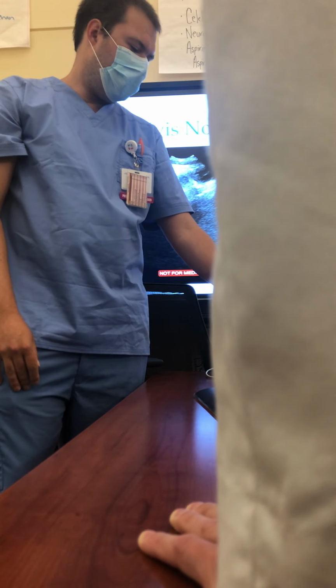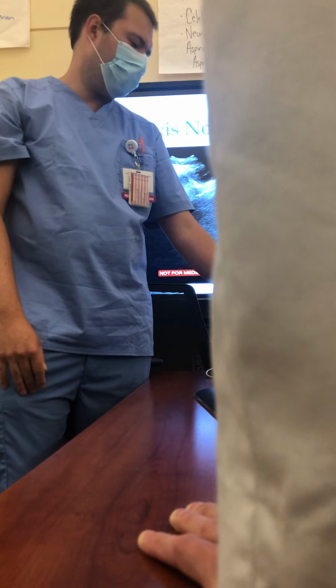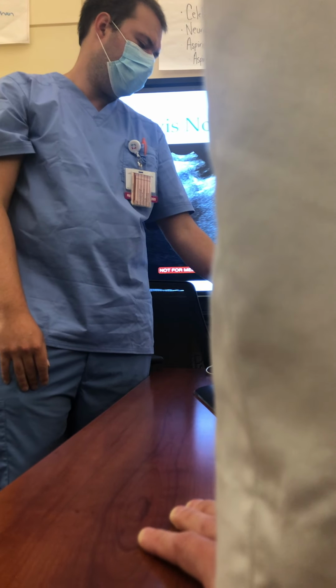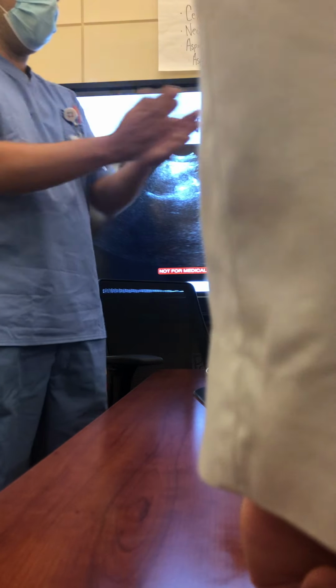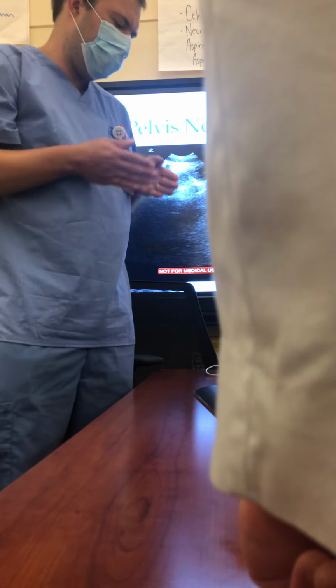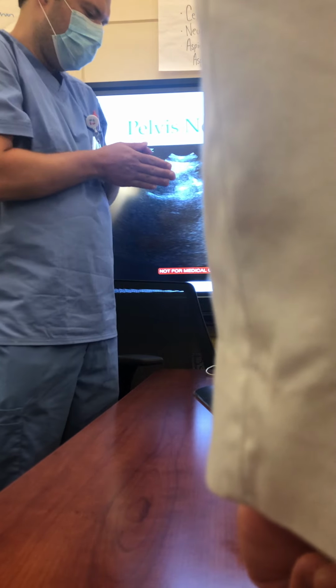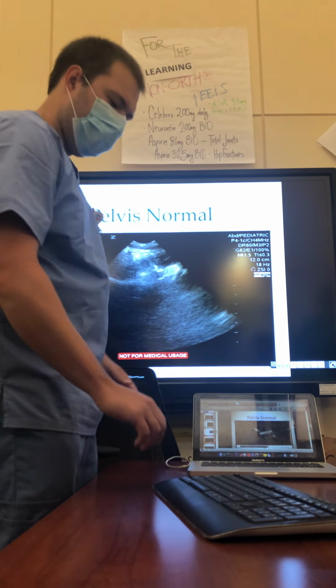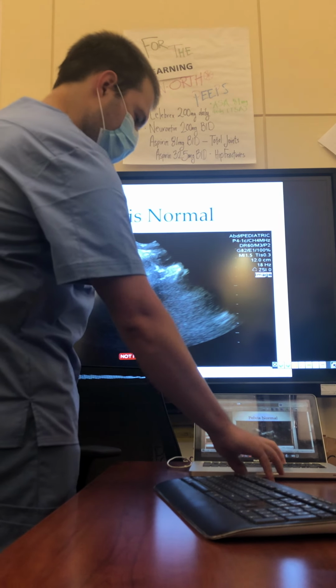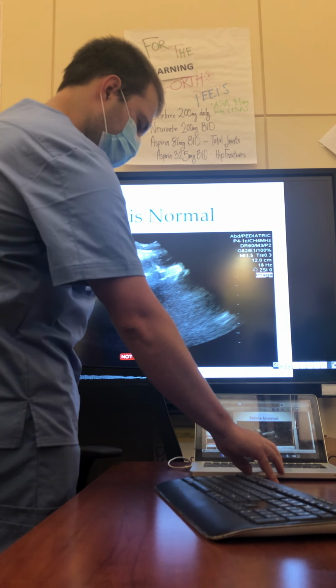This is probably the bowel wall. The seminal vesicles also come through here, but this looks more like the bowel wall. It has two sides to it. It's very linear. It travels in a very straight line, which when you play the clip, you can see when the scanner scans through it, it travels in a very straight line, whereas free fluid is going to be more irregular. If you see that, you just have to kind of scan through it and see, but a lot of times that's called as positive when it's not.